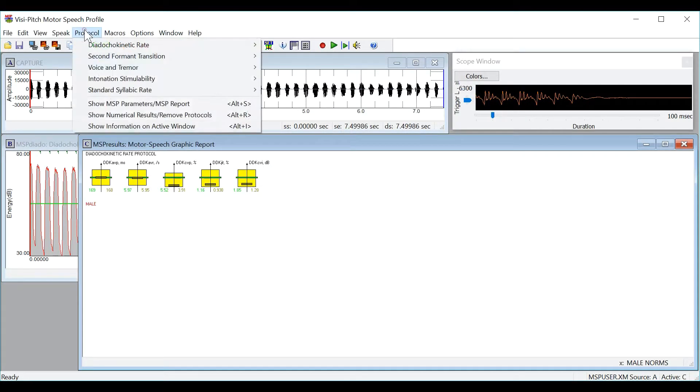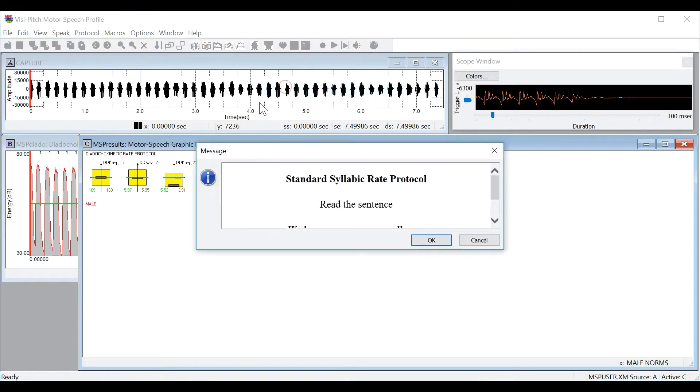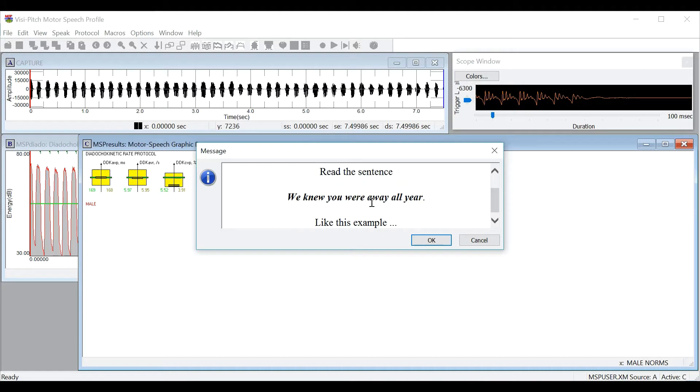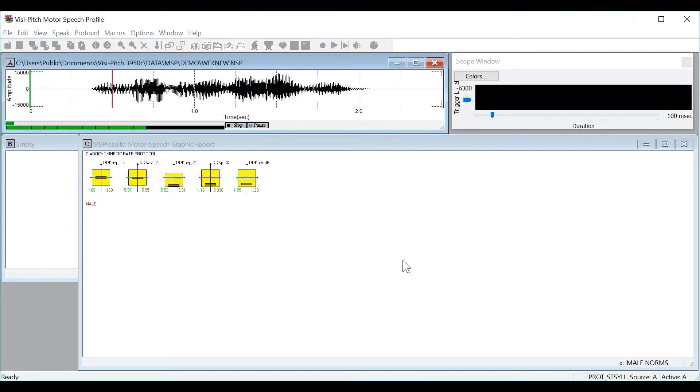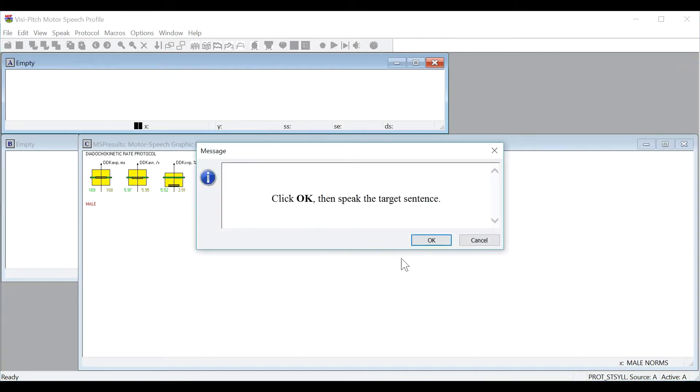Let's do another protocol and we will do the standard syllabic rate. Again we will record a new live input. Again it will tell you what the protocol will be and show you an example and record your own sample.